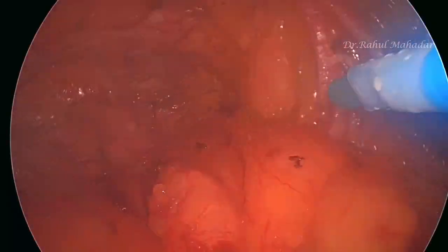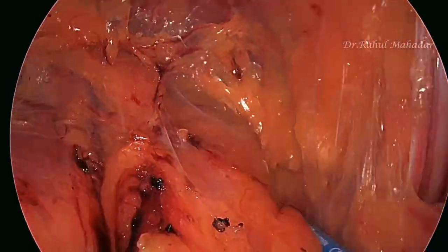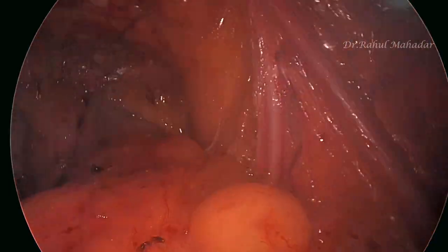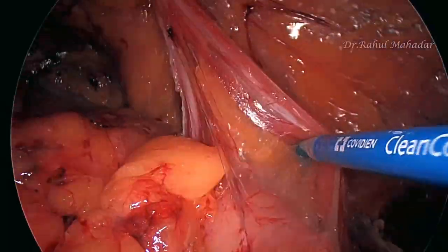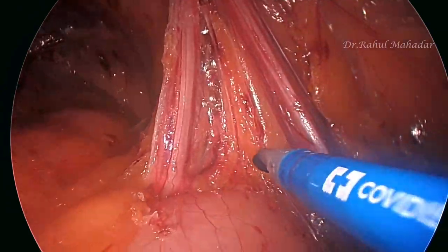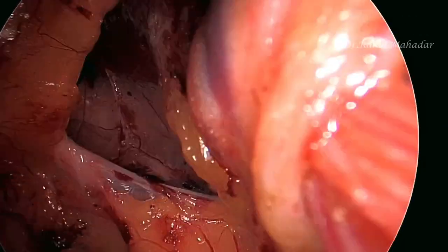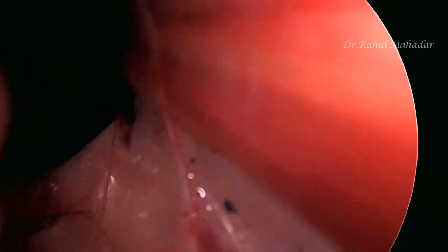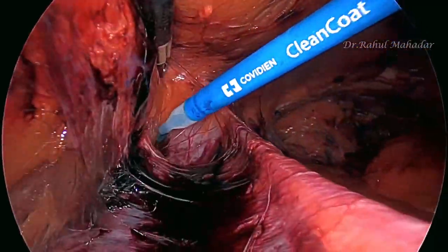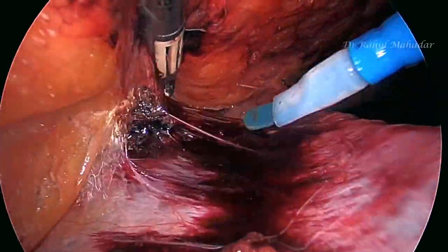The parietalization of the cord structures is almost completed, with a few remaining attachments being taken down. This is now the hernia defect on the right side — quite large. We then place a lateral trocar and begin the left side dissection.